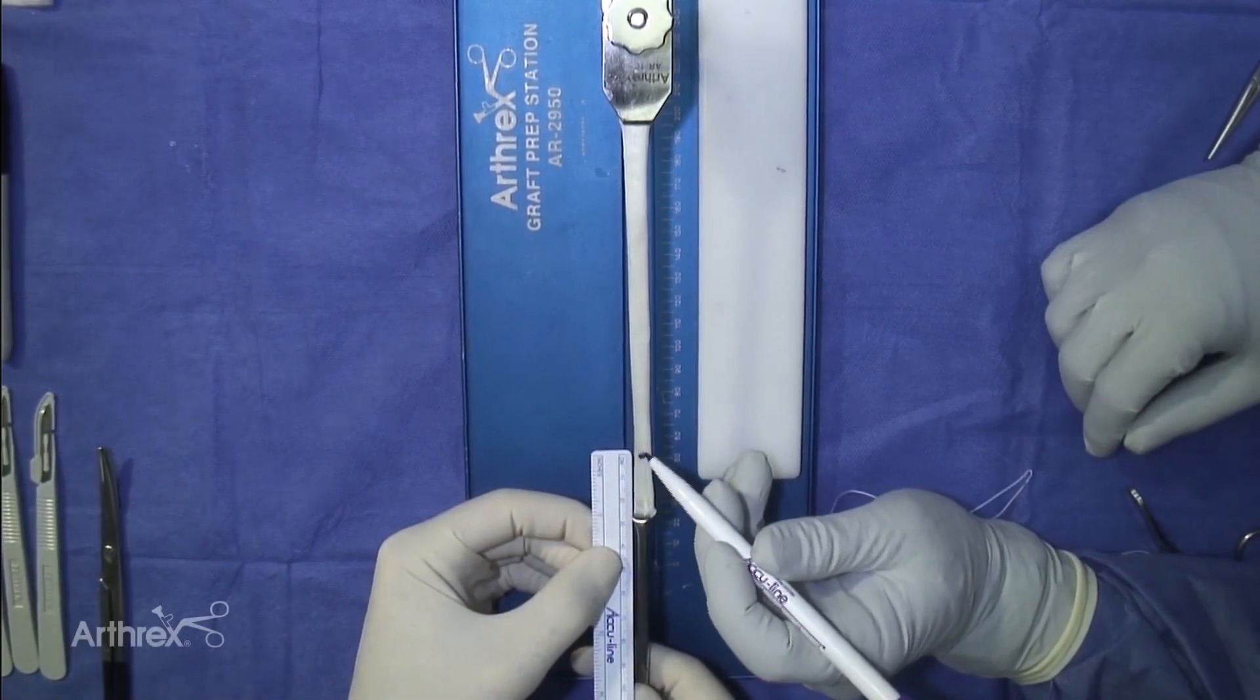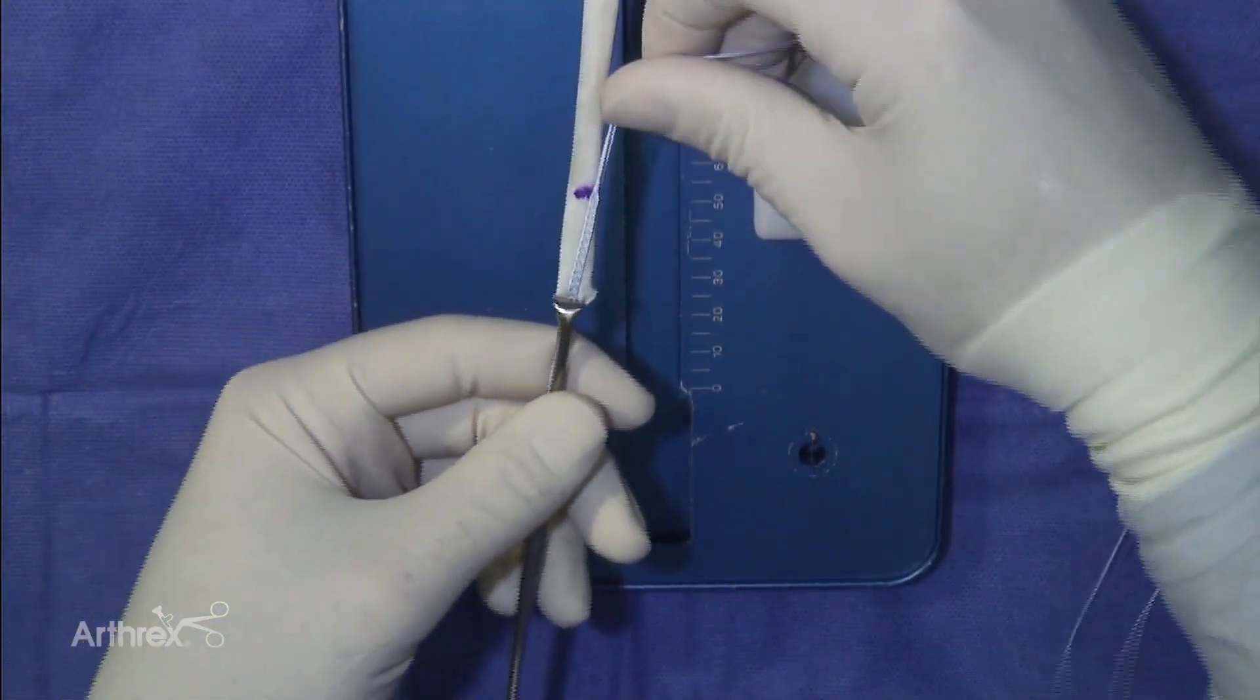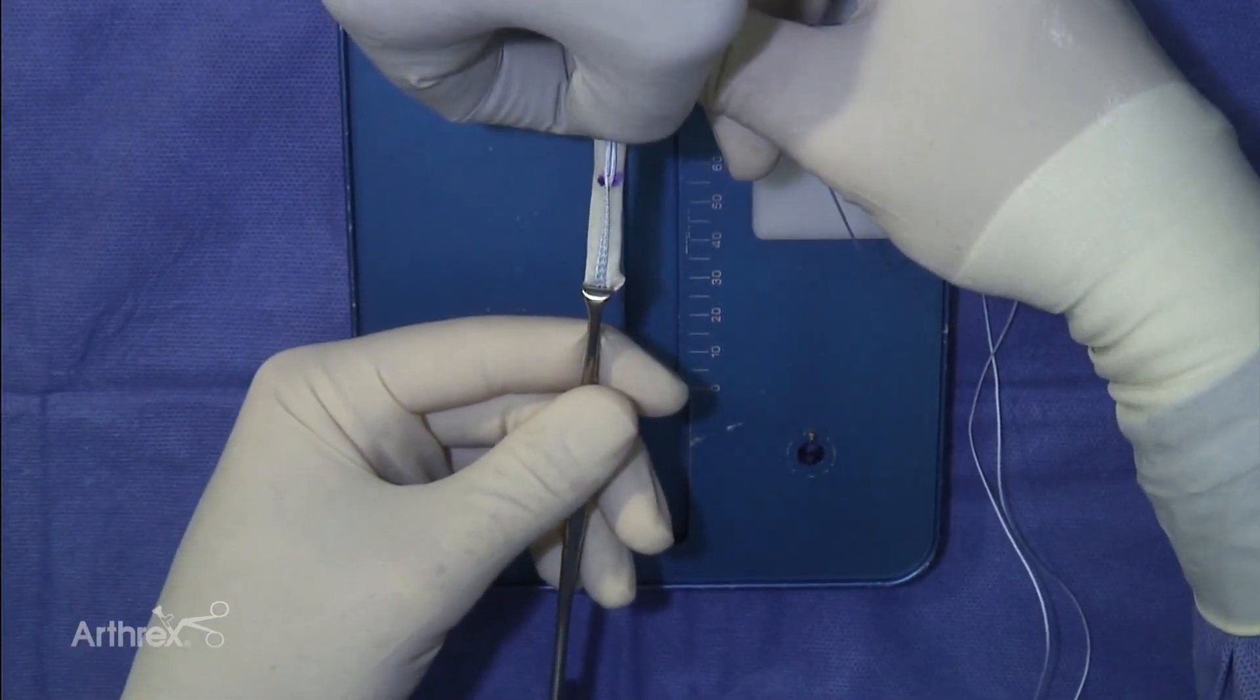Mark the graft at the desired length of the whip stitched portion. An Alice clamp may be used to hold the fiber tag together with the graft at the very end of the graft.